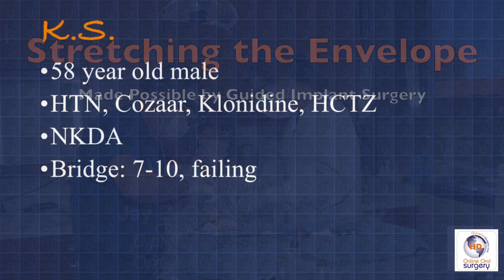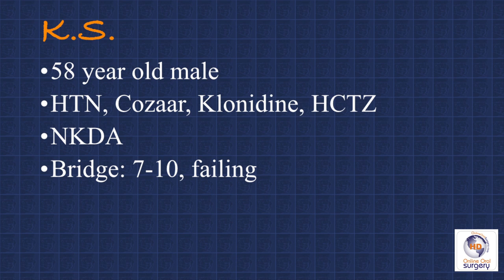One of the things that I really love about computer-guided implant surgery is the fact that it allows me to push the treatment planning envelope to its boundaries. I can do that because the software allows me to do prosthetically driven implant planning, which means that I start with my final result and work backwards from there. I can then visualize where the implants need to be and then use that information in order to develop my implant surgical sites so that the implants are in exactly the right spot for where they need to be.